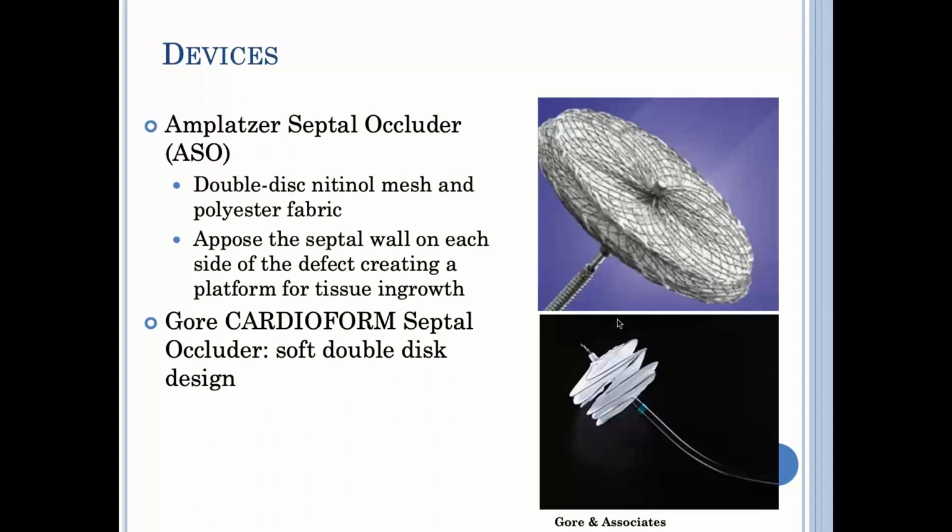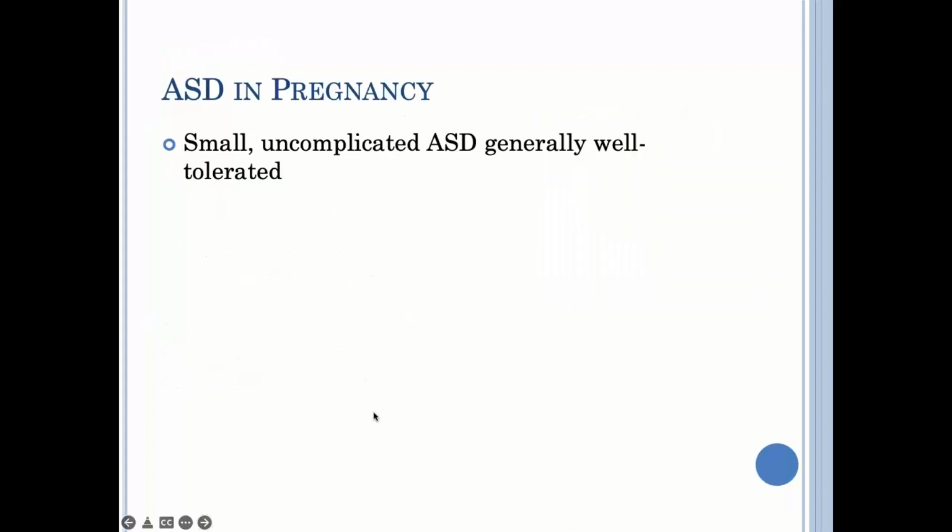It's also a double disc design. This is what it looks like when it has not been deployed, and it serves a similar function. And because it's soft, it may be slightly more maneuverable when they're trying to close a defect.